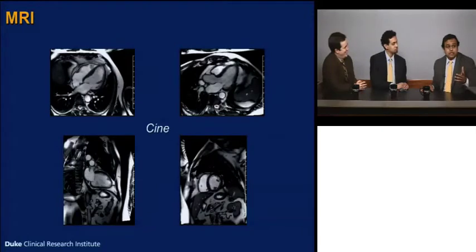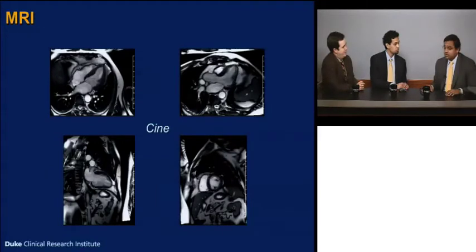And looking at these pictures, without looking at the delayed enhancement pictures, I would say, first of all, viability is often not a yes-no, is it? It's sort of a gradation. The team's trying to sort out what the probabilities of success with revascularization are. But what do you think of that ventriculography? I mean, the cine function of the left ventricle seems pretty good, not too bad.